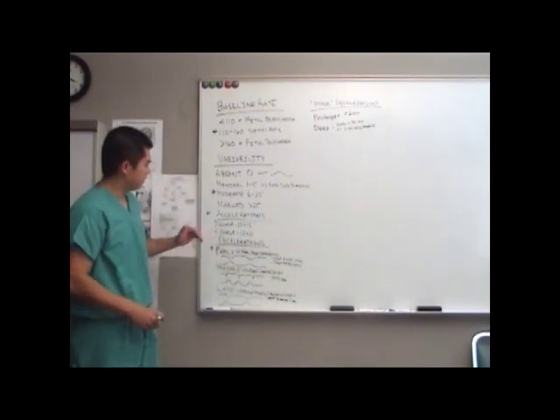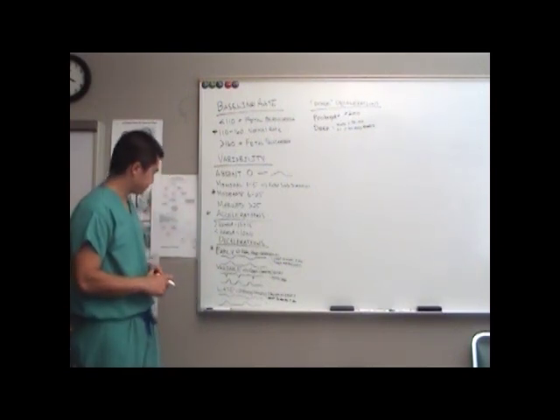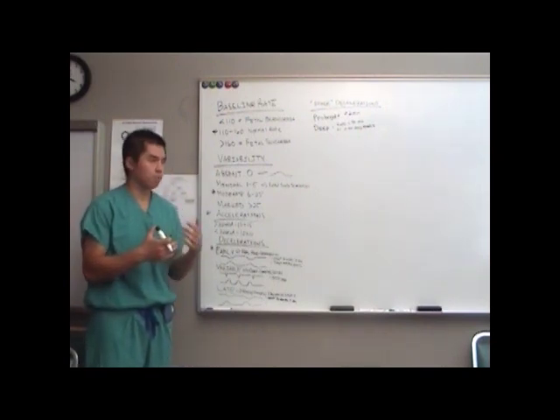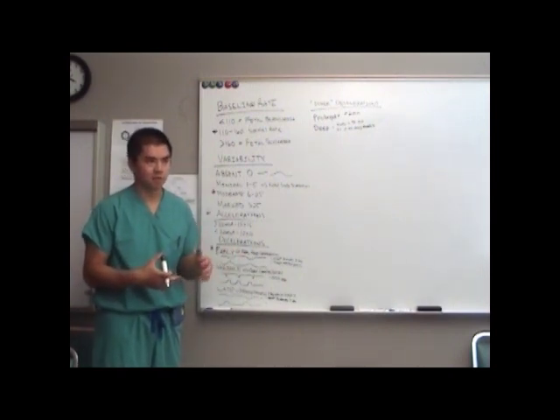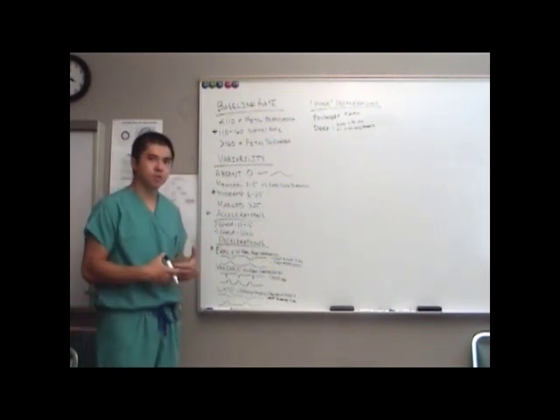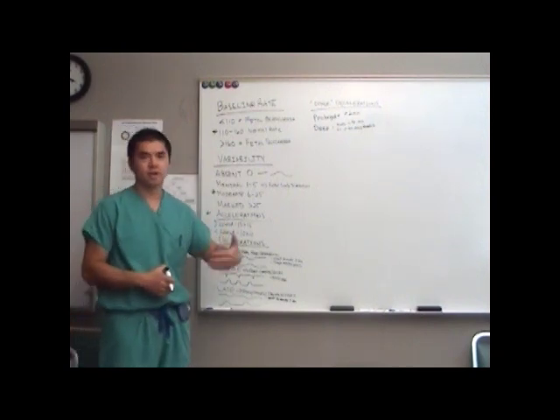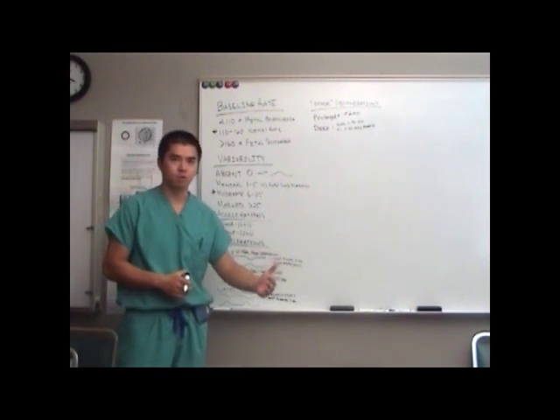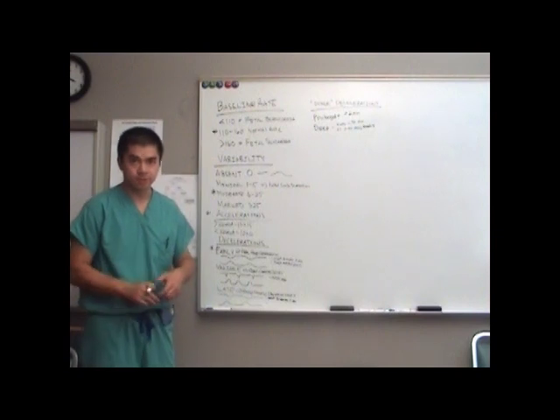There is no minimum drop necessary for an early or a late deceleration. So if you call your baseline rate 130 and the heart rate drops down to 125, you might find yourself saying, oh, that's just a subtle, small drop. But a deceleration is a deceleration is a deceleration, or you might hear people say, a late is a late is a late. So it doesn't matter how far it drops. As long as it drops below your baseline, it's a deceleration if it meets just these two definitions.